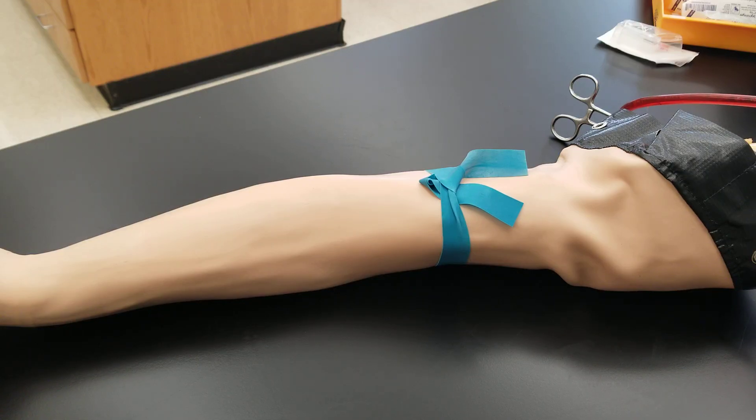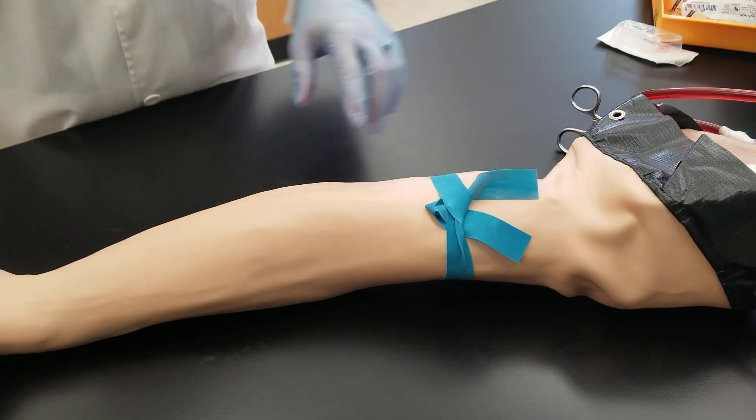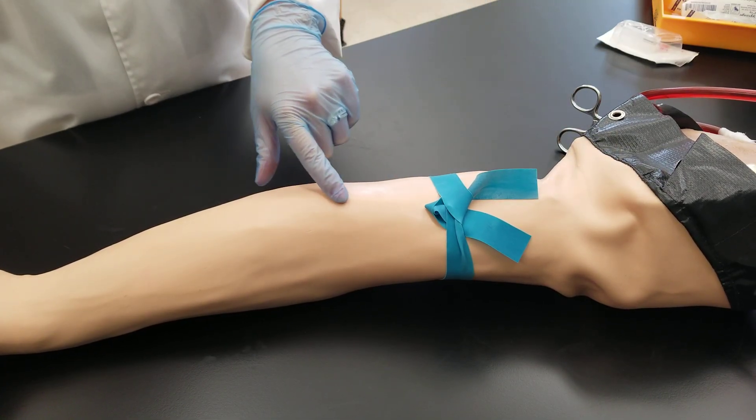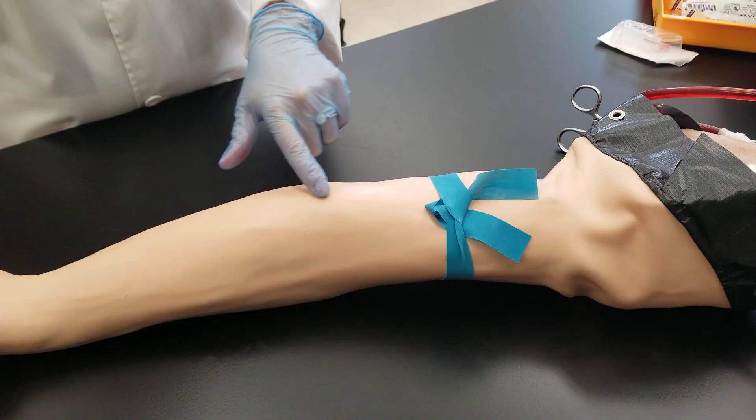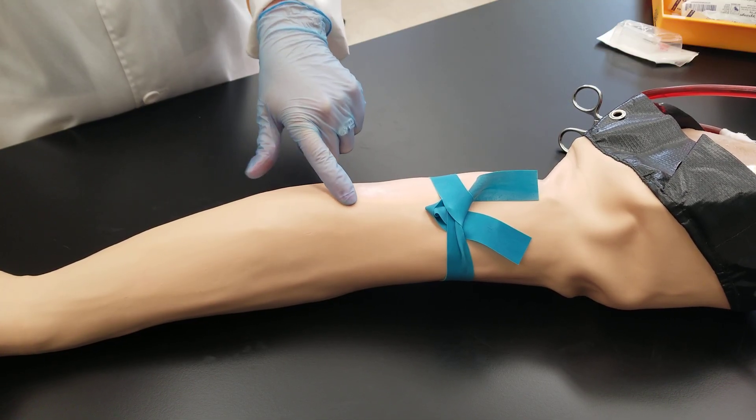Hello everyone. Today we're going to be talking about how to perform a good tourniquet application. So what we're going to end up using for the venipuncture draw is the median cubital vein right here, as discussed in another video.